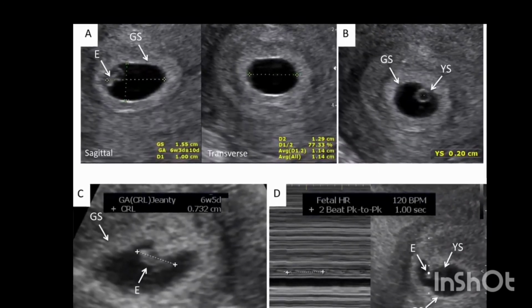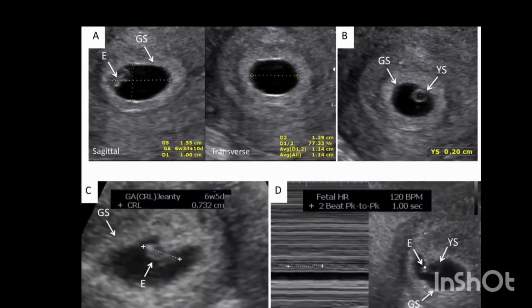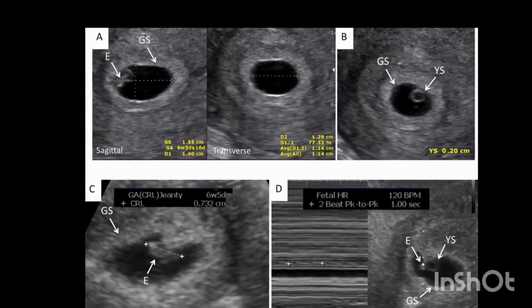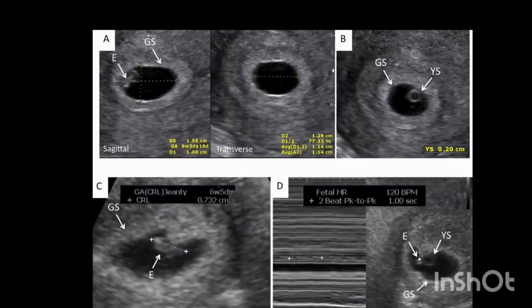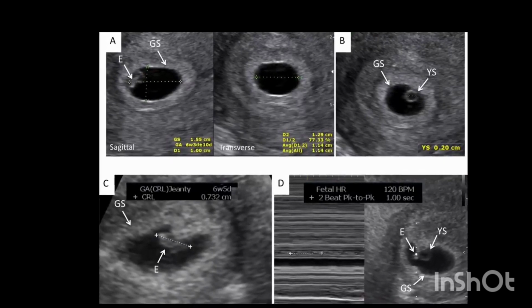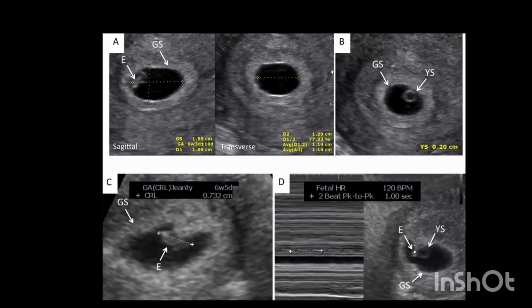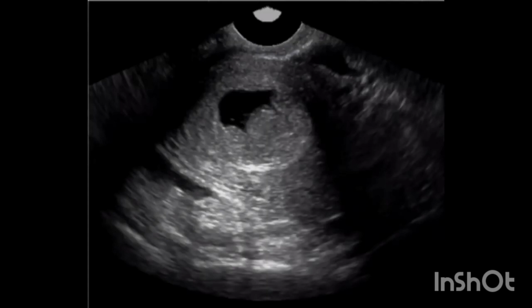The gestational sac is normally contained within the uterus. It provides an embryo with nourishment, food. It helps circulate gases between mother and the embryo. The yolk sac also produces cells that turn into important structures, such as the umbilical cord, blood cells and reproductive organs. An abnormally shaped gestational sac or yolk sac should raise concern for a failing pregnancy.